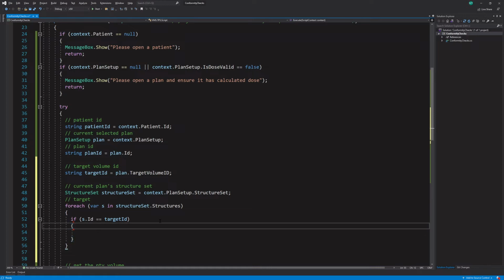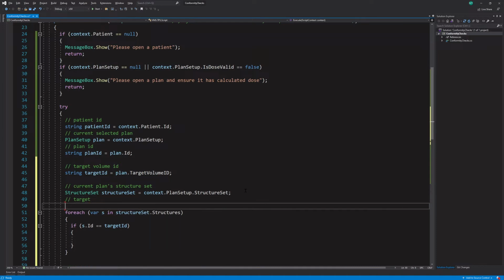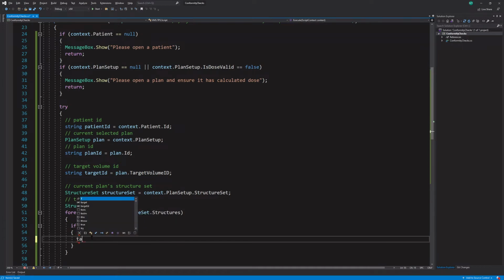Okay. So what we want to do is declare a target outside of this if statement. That way we can use it outside of these brackets. So we want to say Structure target. Okay, that's all we need to do. And it's just complaining. It's not even really complaining. The green squigglies just mean, hey, what's going on here? Maybe you don't need this. So what we're going to do is say target equals s.